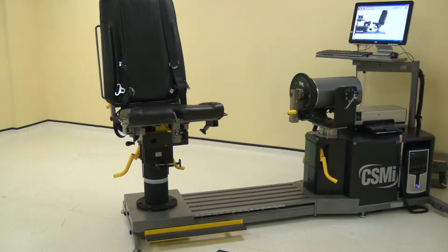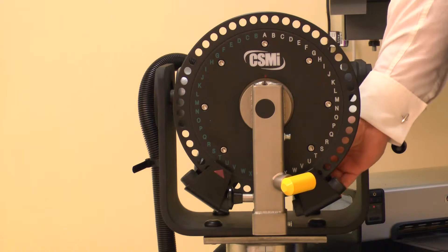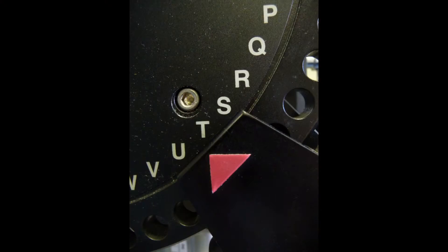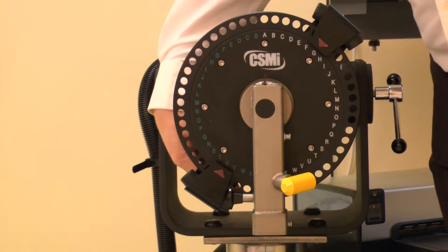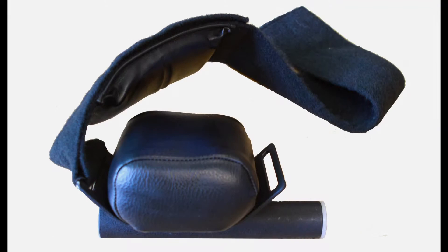To position the machine, first ensure all of the adapters and stabilizers are removed. Move the first dynamometer stop to position T on the wide scale. Now move the second stop to position N on the green scale. Collect the adapters and stabilizers for this position.